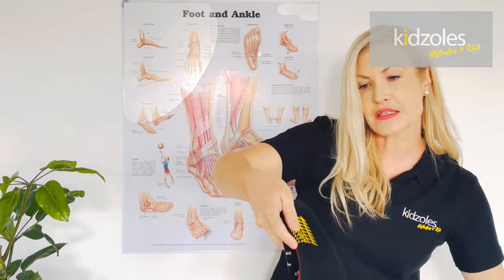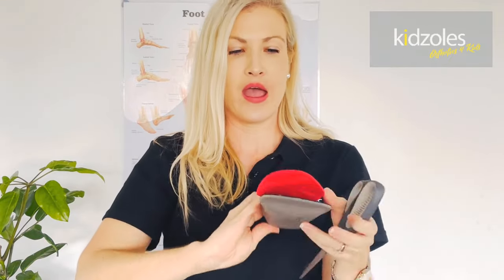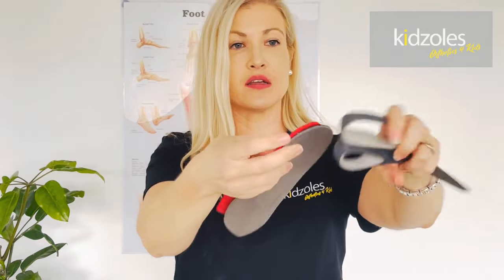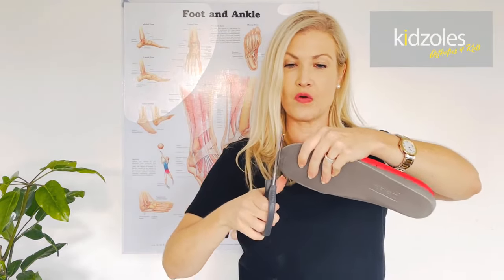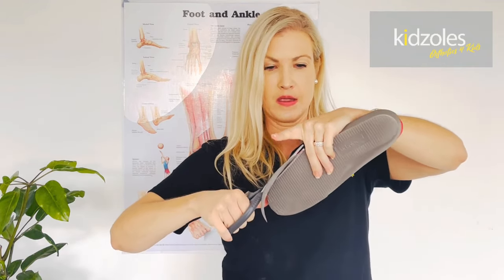Line up the back of the heel and get it nice and centered, and now you can see where you're going to need to cut. It's pretty simple — you can either draw around it if you're not feeling too confident, or you can just hold it in that area and use your scissors.